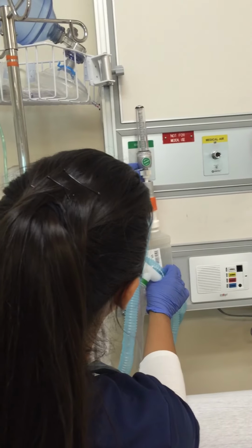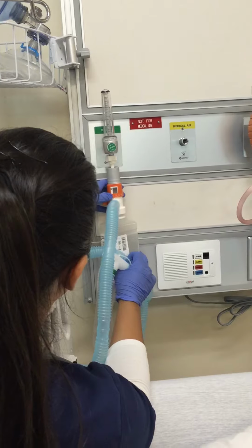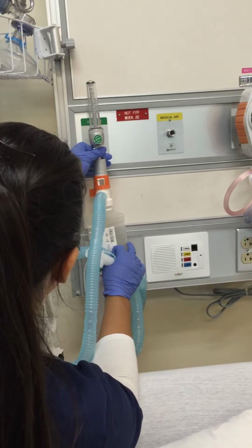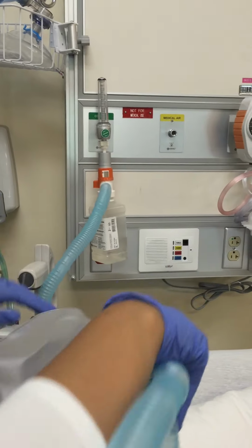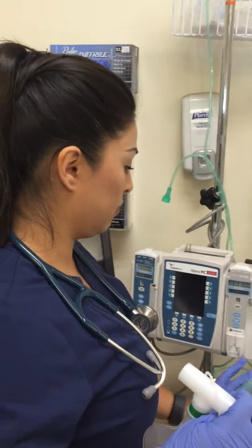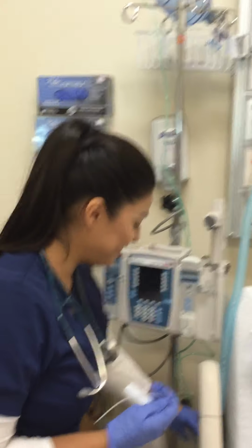I'm going to put her on about 5 liters, and I'm going to put this to 28%. That way I can give an exact FiO2, so that the LVN can humidify the right amount of dose.